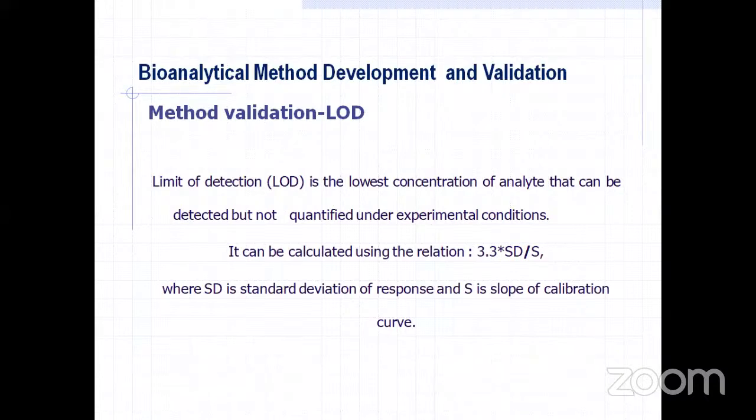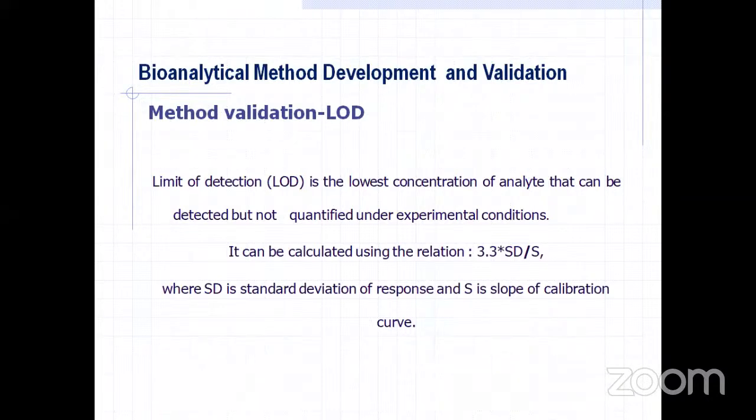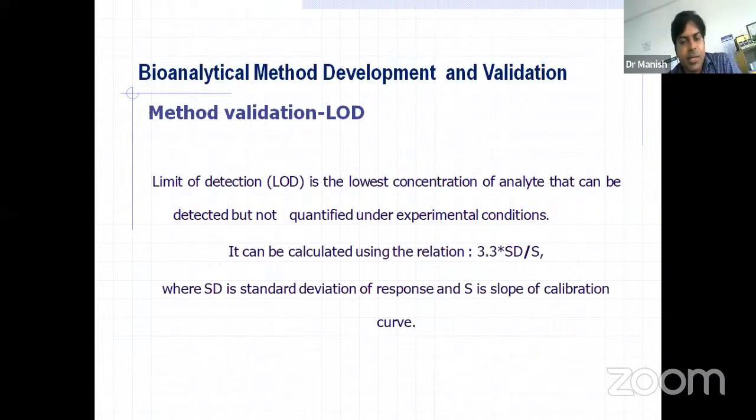Suppose you are preparing MQC, MQC should be 60% concentration of C1, and HQC should be 90% concentration of C1. The simple method is to regularly divide the first two concentrations by 2; in that manner also you can prepare quality control standards.